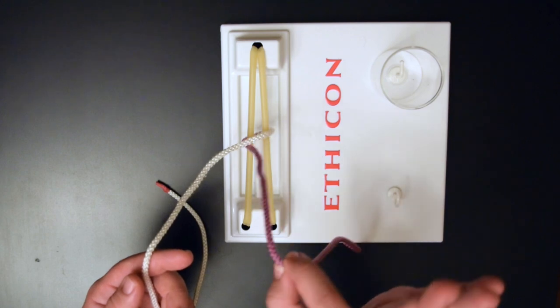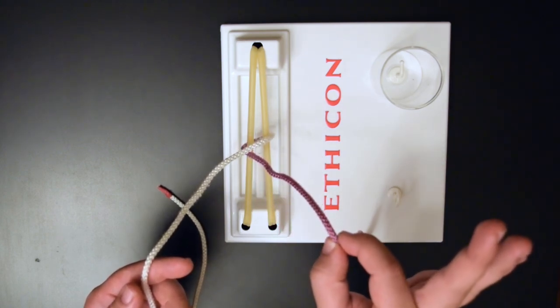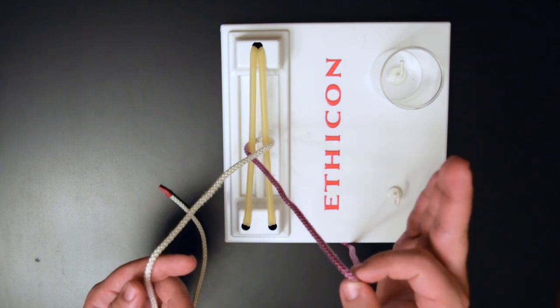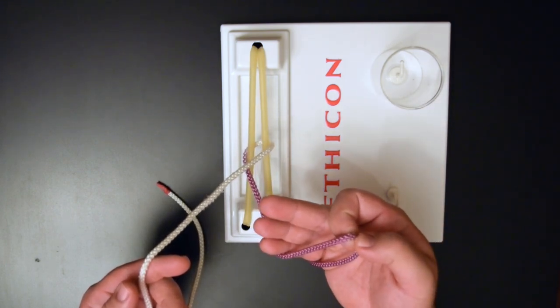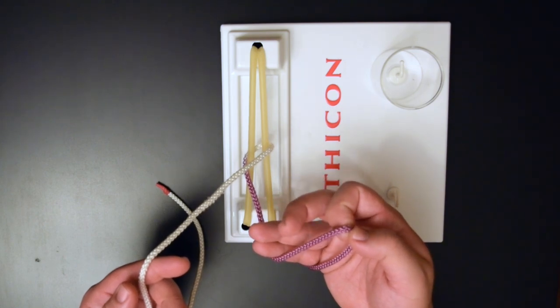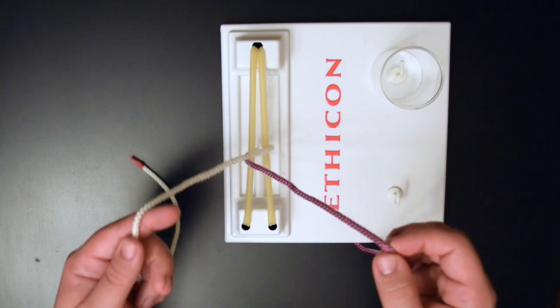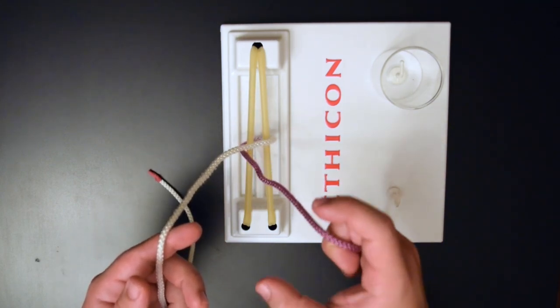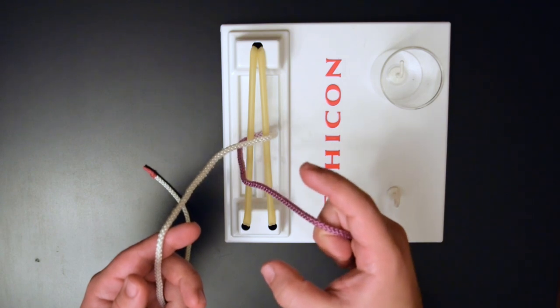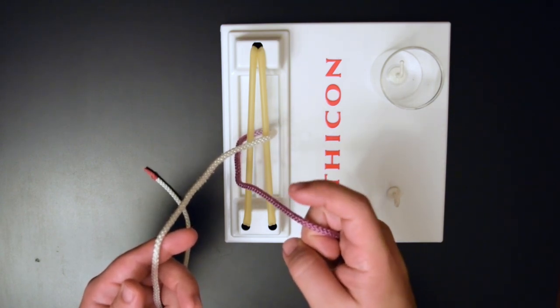Let the suture drop down and form an OK sign — that's one of your throws. It utilizes your three digits and your middle finger is going to be doing most of the work. Your second throw utilizes a C shape, and your index finger is the one that's going to be doing most of the work.